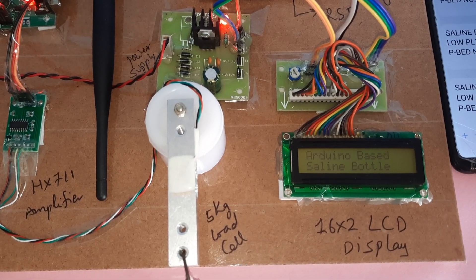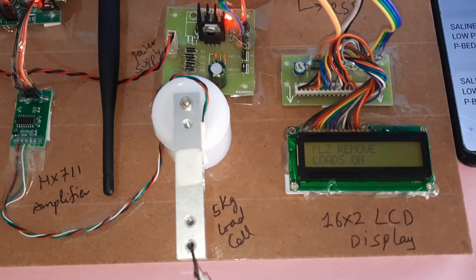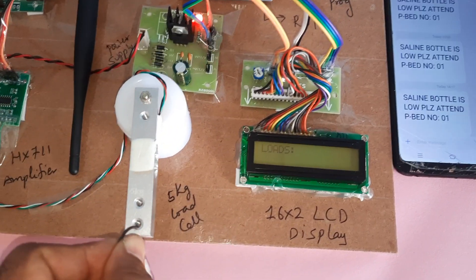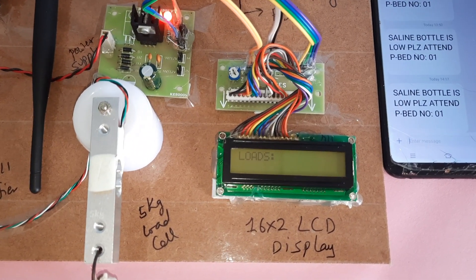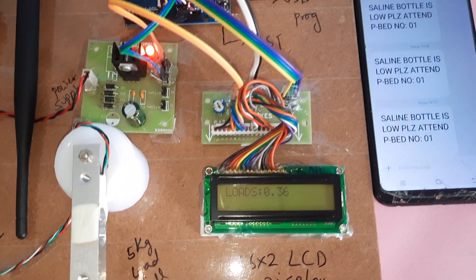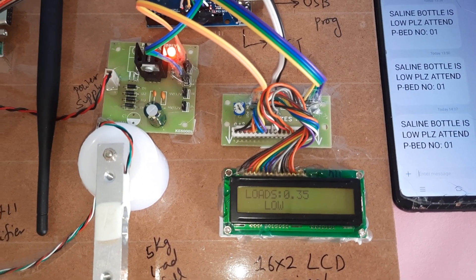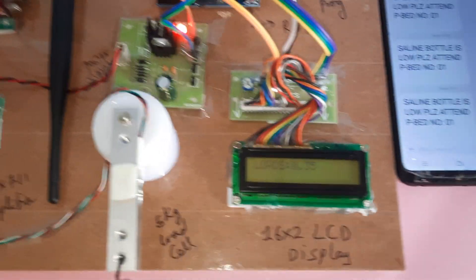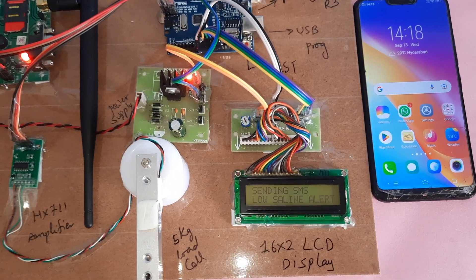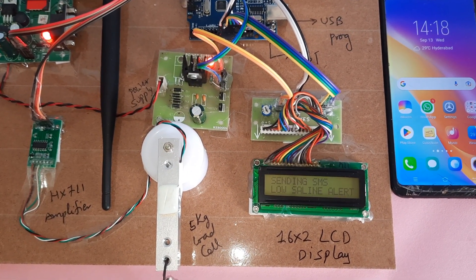Now I am going for the reset button. Arduino-based saline bottle weight monitoring and alert system — now it is 0.00. I am adding water again: 40 and below is low level; after five seconds it will send the SMS alert. Saline bottle level low — message sent.